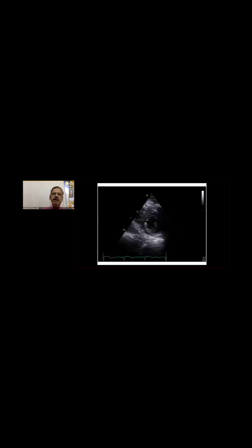Not only RV dysfunction, subclinical dysfunction can also be calculated. There is a 30-year-old lady presenting with peripheral edema, anorexia, nausea, abdominal pain, hepatomegaly, fatigue, and dyspnea. This is a good LV, there's nothing to see. But see, the RV is not moving normally. The RV is also enlarged.